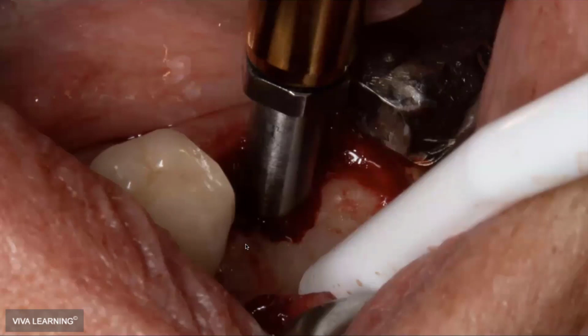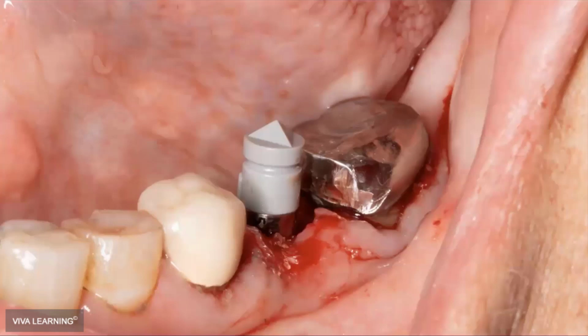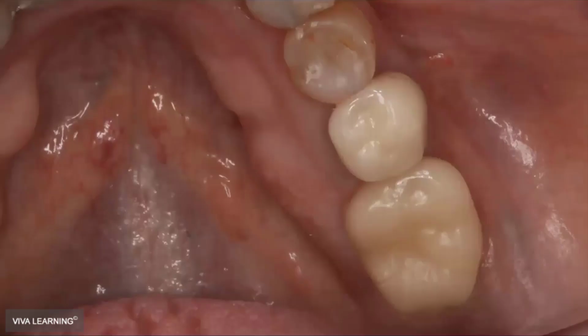I'm being critical, it's leaning distal a little bit, but I think the patient's going to be just fine. So there's the same day placement. It's subcrestal. We put our scan post on there like we always do, so that we can make this crown, assuming we have uneventful healing. And then the patient comes back, but I felt more comfortable doing the same incision again, that lingual to lingual incision, so that I could push all that keratinized tissue buccally and then place the implant.